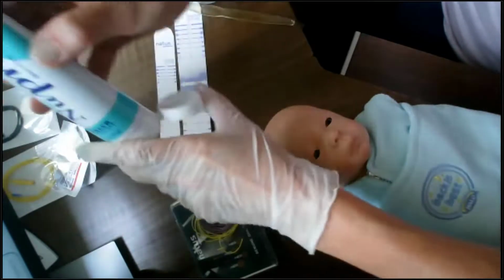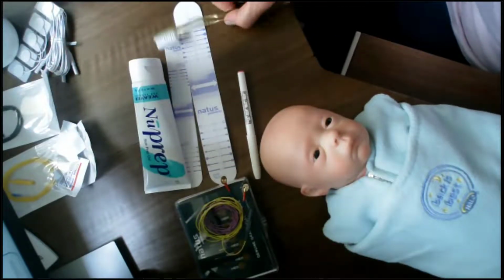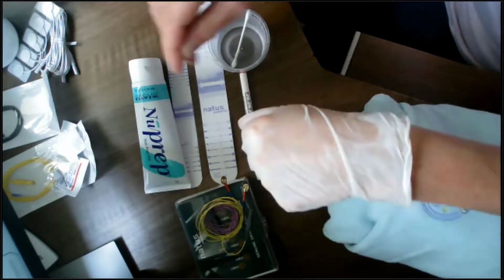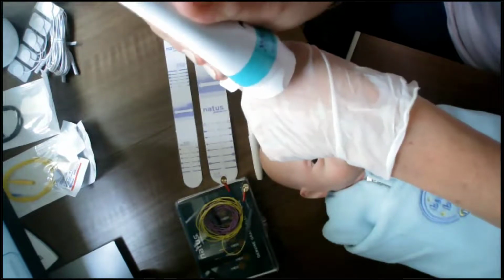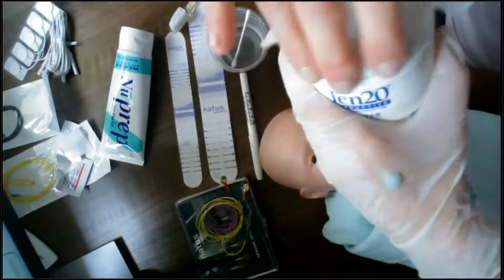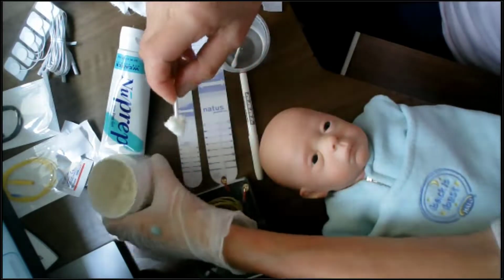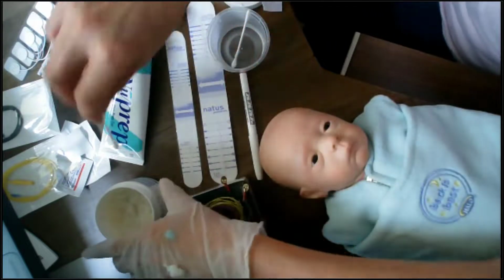I'll have my positioning aid, I'll still have my Nuprep, my skin marker, I'll have my toothbrush if I need to, and my water to prepare to move to part the skin. Again, remember I said I would put some Nuprep on my hand, so I'll actually do that. And then I also, as I mentioned, take a decent amount of 10-20 paste and put this on my hand as well. So I'm going to get a great big blob of 10-20 paste and put that on my hand also.